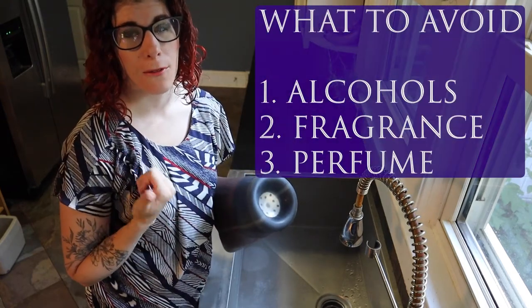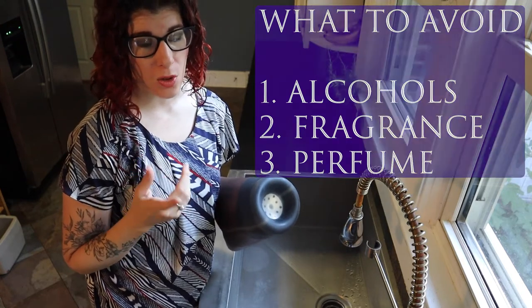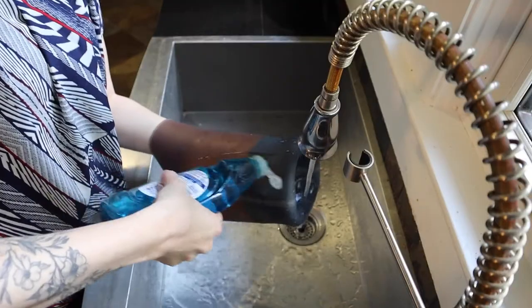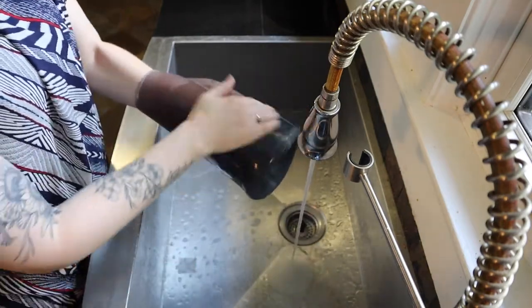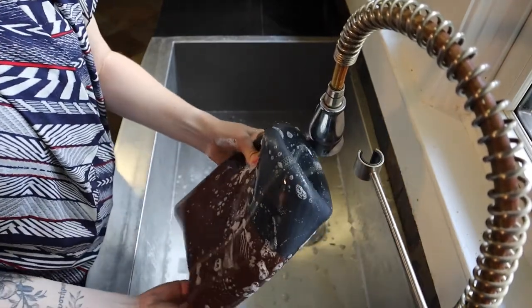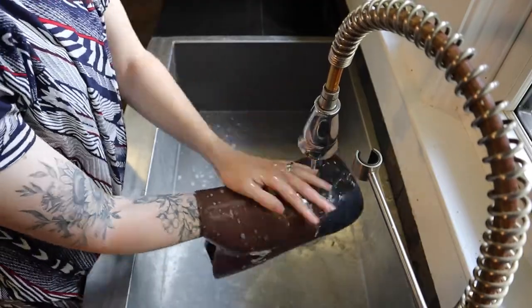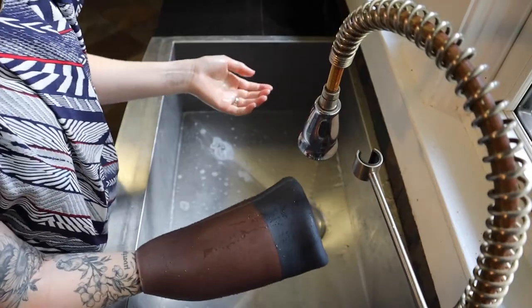You just want to make sure that you avoid harsh antibacterial soaps or soaps with fragrance or perfume — that's just going to open the door for potential skin irritation. So lukewarm water, and we're just scrubbing down the liner, getting all the areas clean. You want to make sure that it is rinsed really thoroughly — you don't want to have any soap residue.